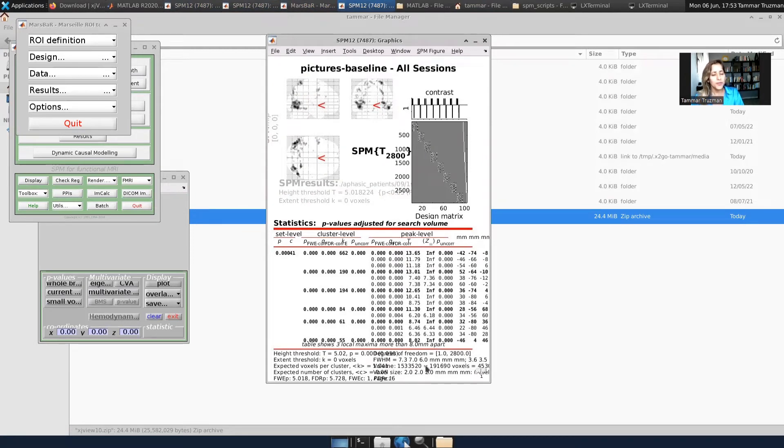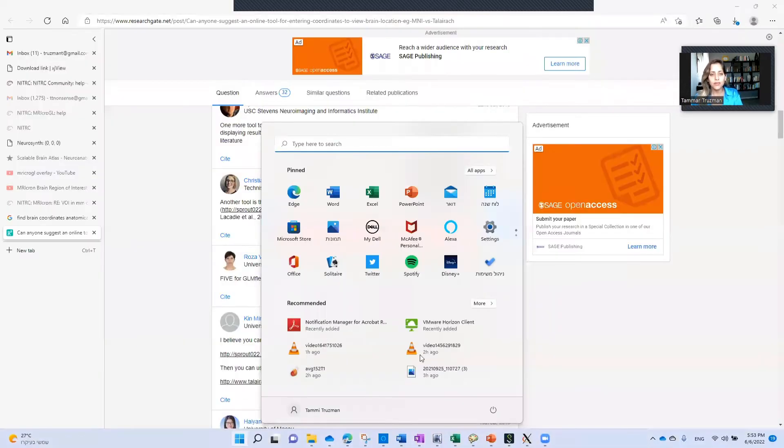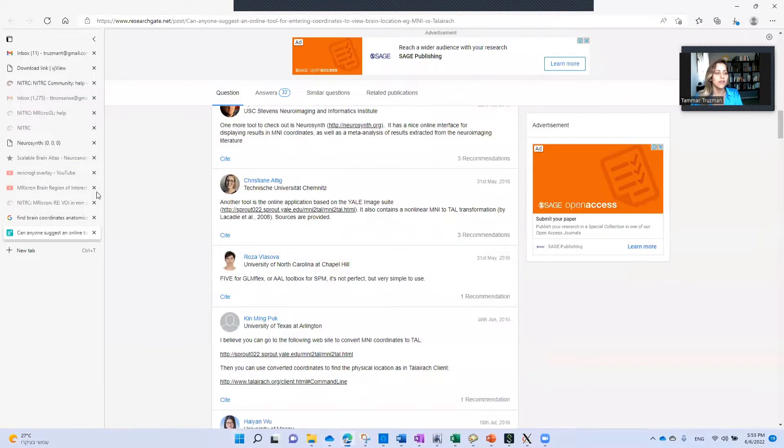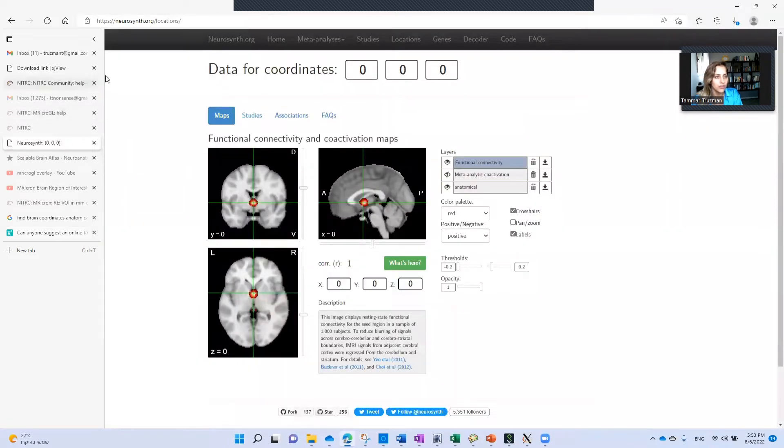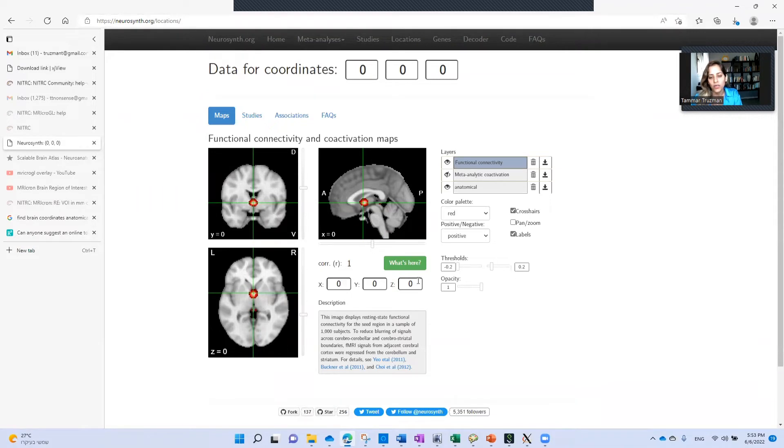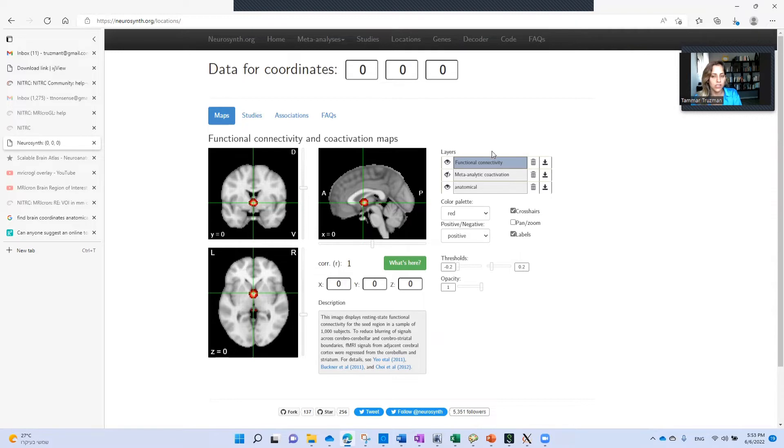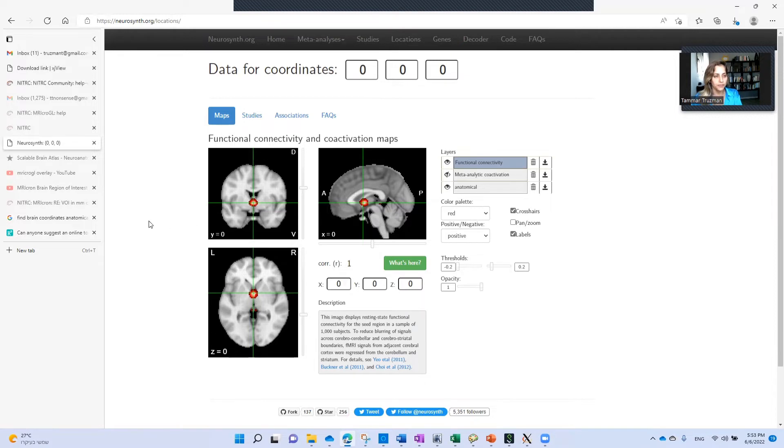If you're only interested in one or very few coordinates, I would suggest finding a simple online tool such as Neurosynth that I found, where you can type your coordinates and find the anatomical labels and maybe other information such as functional connectivity studies that found this region activated during some tasks.